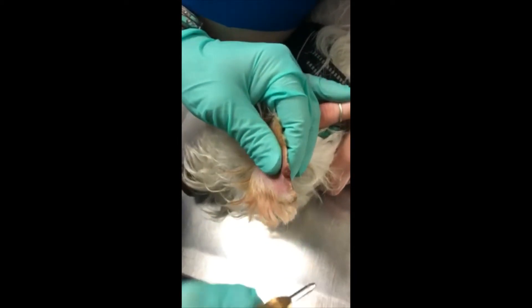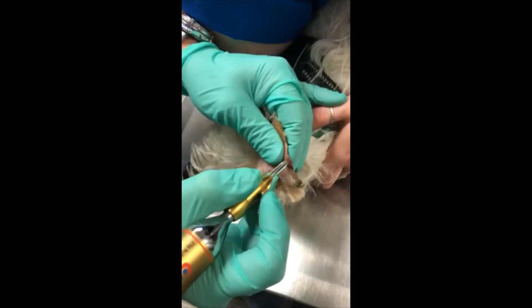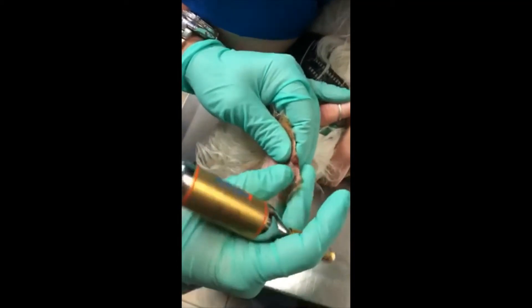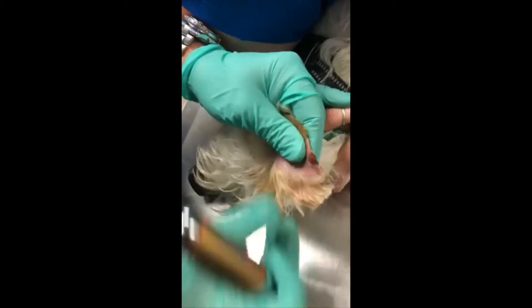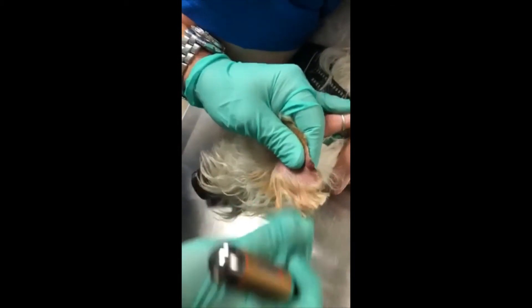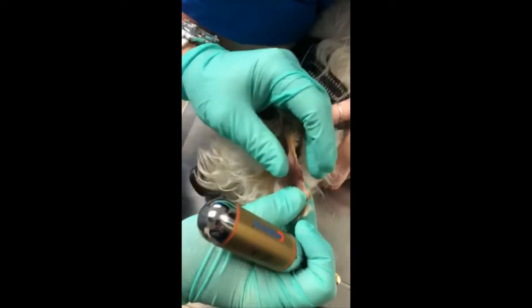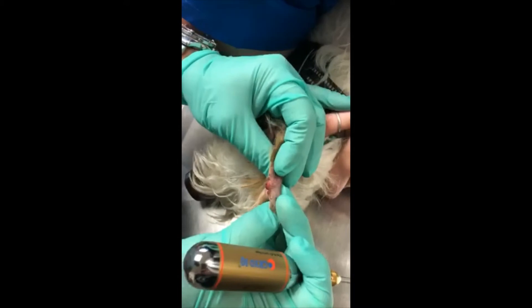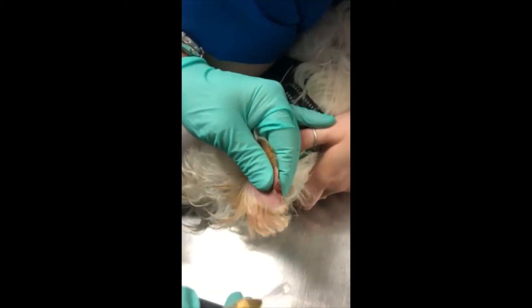We're going to do a 40 to 45 second freeze followed by a thaw cycle, followed by a second freeze cycle, and then we will give it approximately two to three weeks to fully go through a cycle. If at that point there's any remaining tissue — as there is some depth to this mass — we'll go ahead and just touch it up at that point in time.